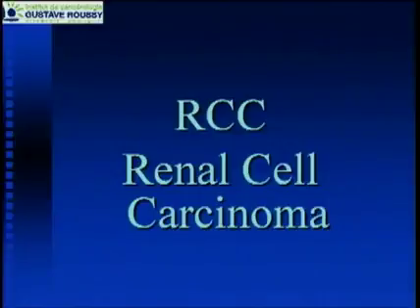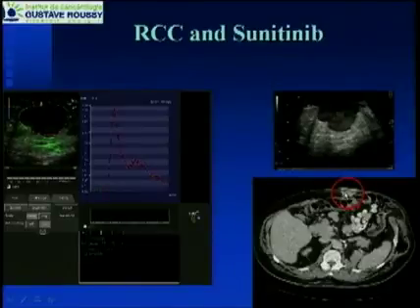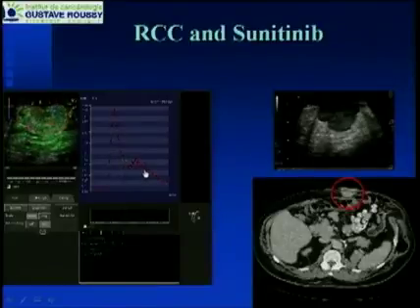So now I would like to show you some examples of patients in different tumors. So we're starting with the renal cell carcinoma. It was a patient with a superficial lesion. You could check on the CT scan, and this is a B mode. You recognize the lesion. And so finally, this is a perfect target without motion. We inject the SonoVue, and you are able to visualize a very vascularized lesion with the wash-in and the washout.